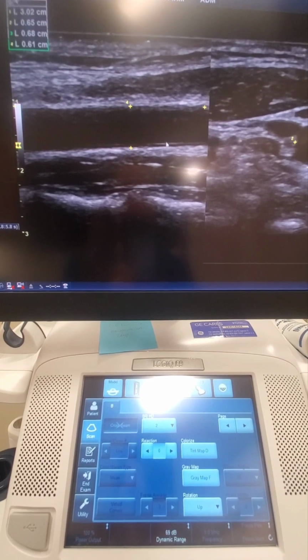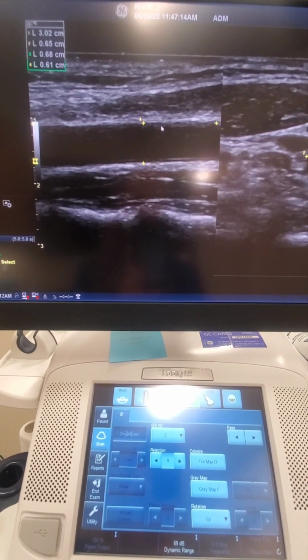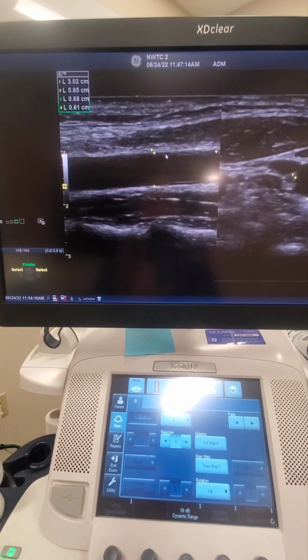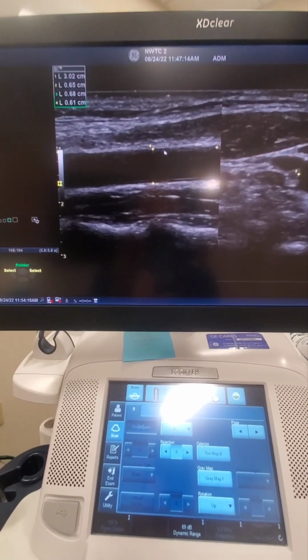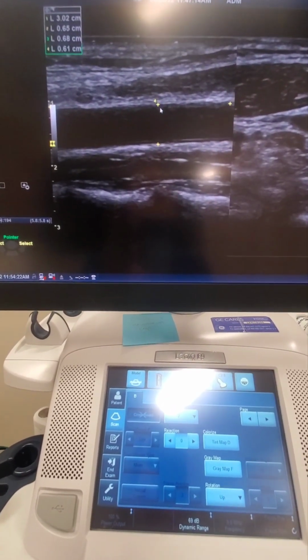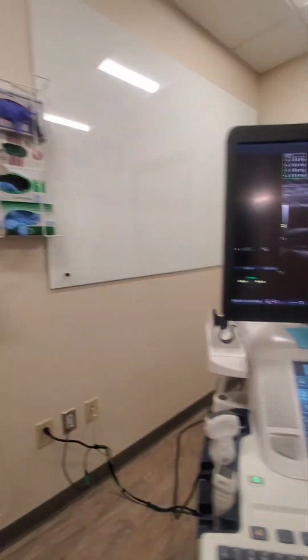You can see them really well. Up here it's more blurred, you can't really see it as well, it's not as well resolved. Those resolutions, the 3 resolutions, what are those? We have axial, we have lateral, we have elevational.